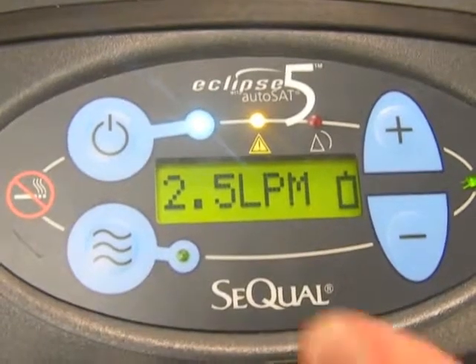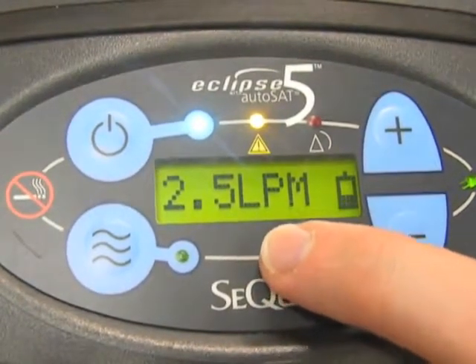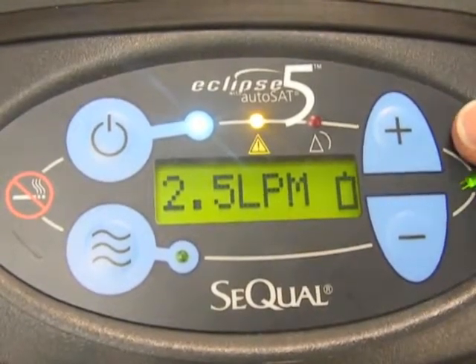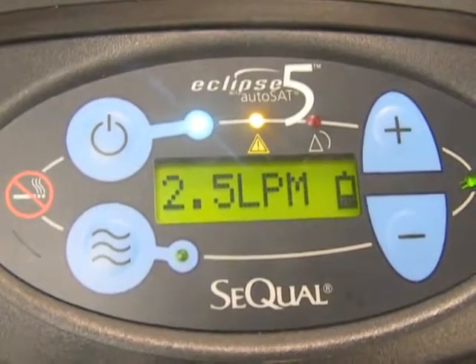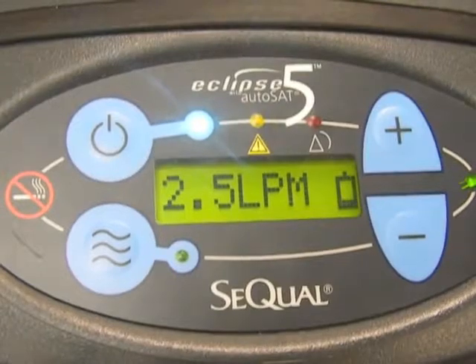As you see here, our flow rate is 2.5 liters per minute. This is a continuous flow setting. If you want to adjust your continuous flow, simply press the plus or minus buttons. The Eclipse does continuous flow from 0.5 liters per minute all the way up to 3 liters per minute.